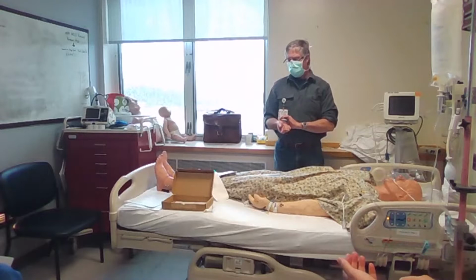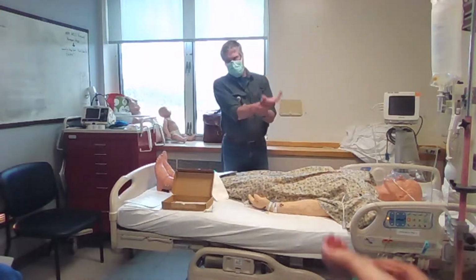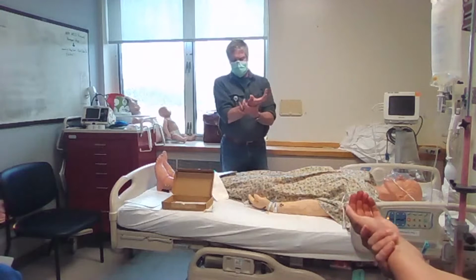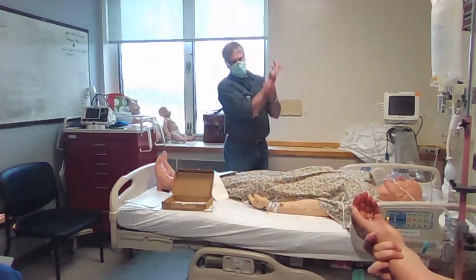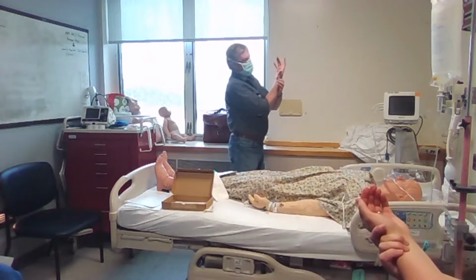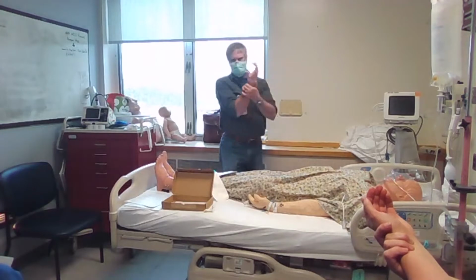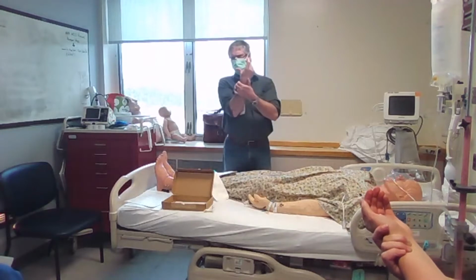So the easiest way to do it that I learned was put your wrist in your hand, take your two index fingers, and put them right below the angle of your thumb. There's kind of a little divot. Kind of feel that little divot?